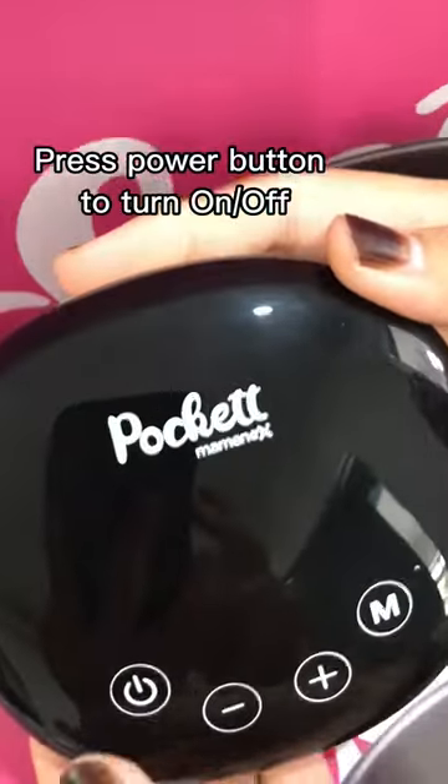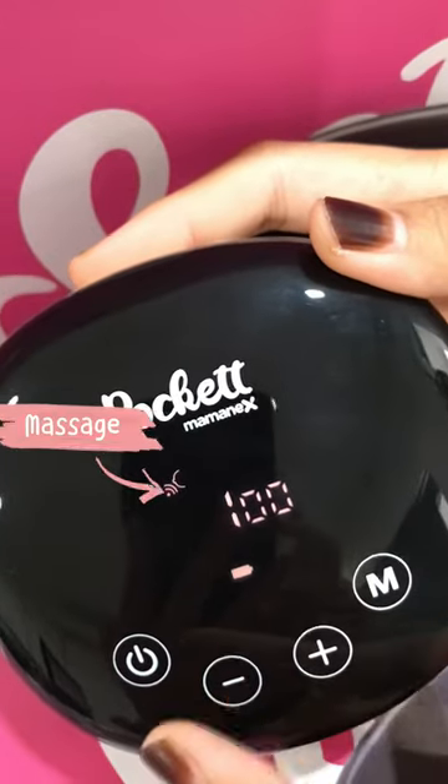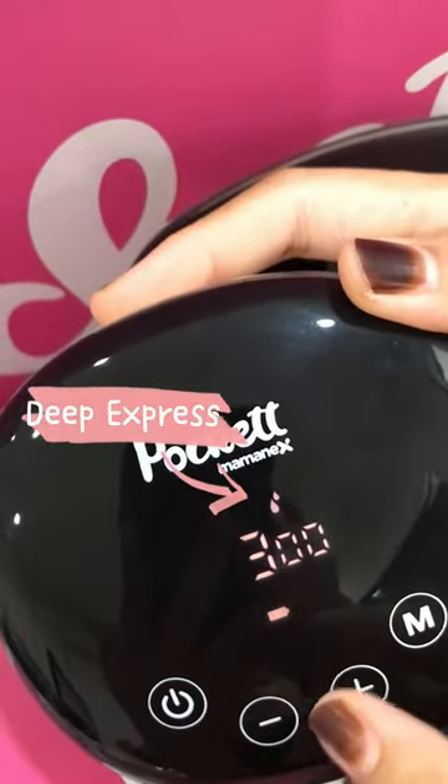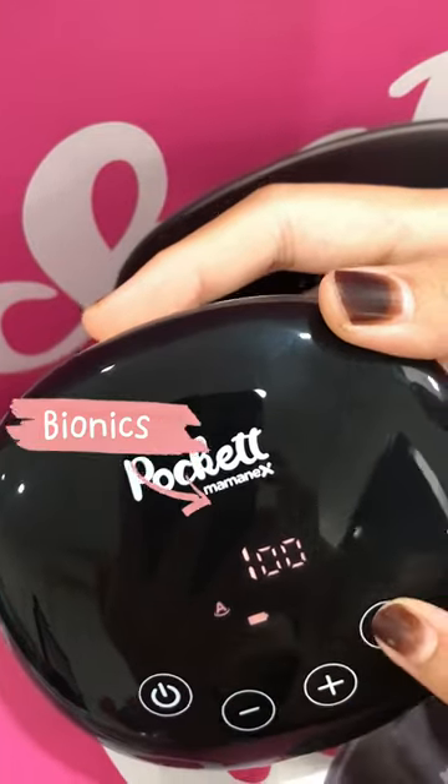Press the power button to turn the device on or off. You can switch between modes: Massage, Deep Express, and Bionics, and Advance.